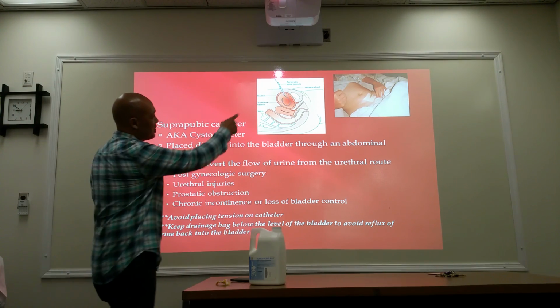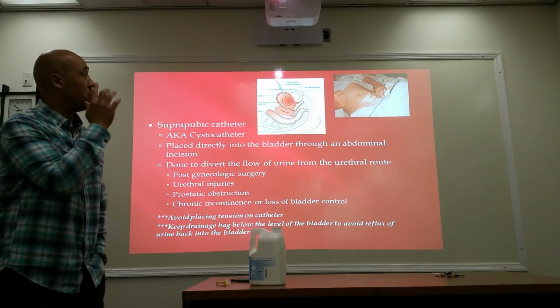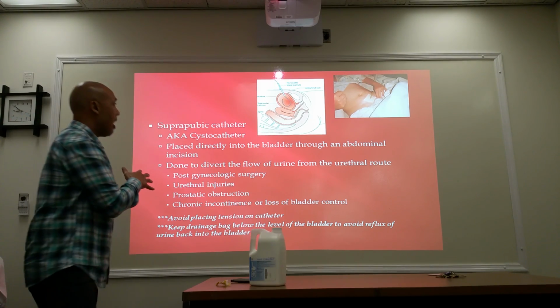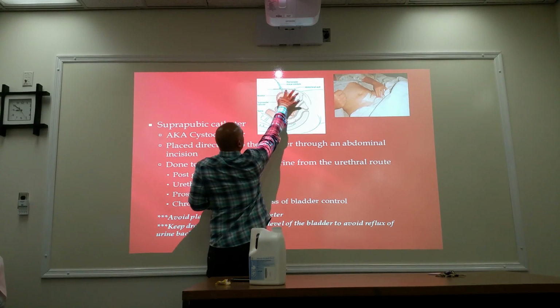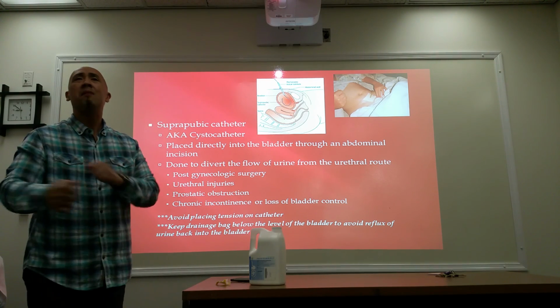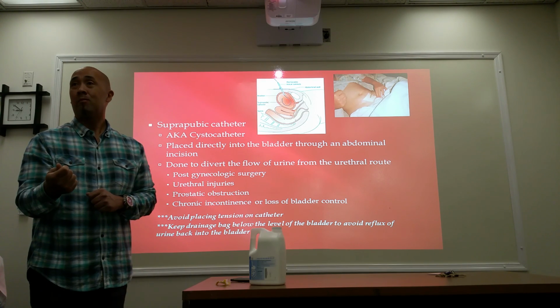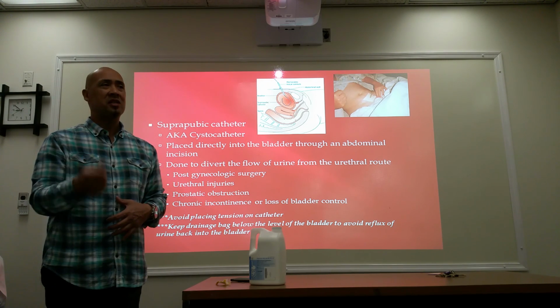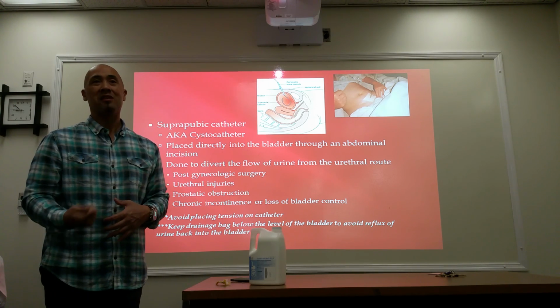So again, an incision is made from the abdominal wall into the urinary bladder. We do this commonly in radiology too. The tube gets placed in. You'll notice there is a plastic plate going across that sits on top of the abdomen, so we can either tape it down or suture it into the skin. The doctors usually just like to tape it down, because once you make incisions into the skin, you increase the chances of causing an infection, because you're breaking the skin.